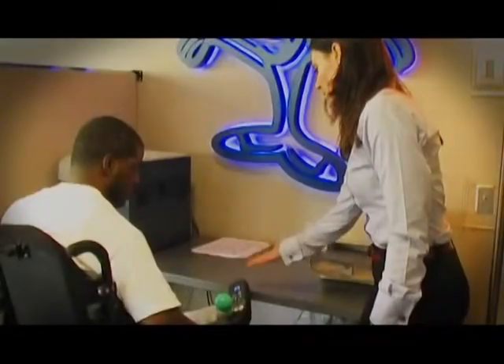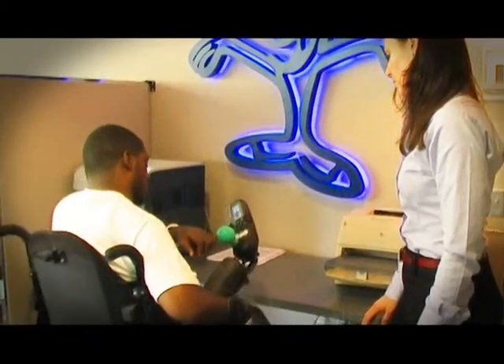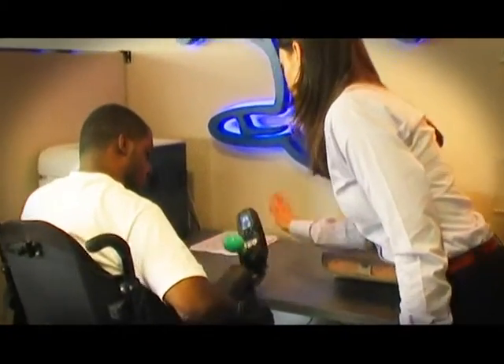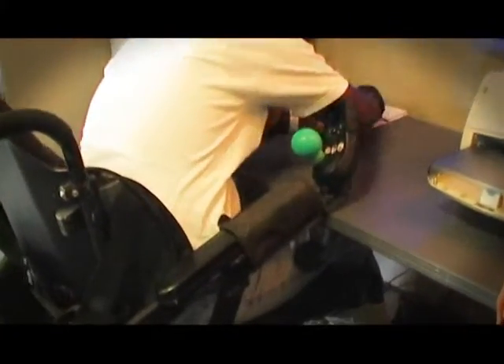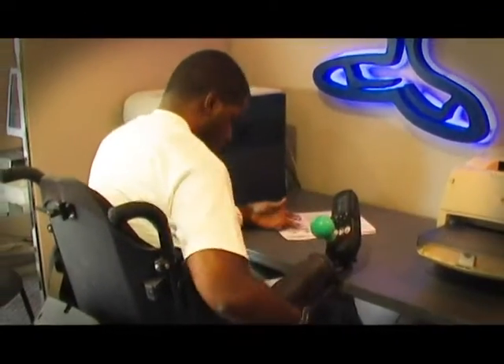Another method is to lean forward on a desk or table. Lean forward in your chair until your bony areas are off your cushion, and hold that position for 15 seconds every 15 minutes or 30 seconds every 30 minutes, unless a different amount of time is recommended by your medical team.